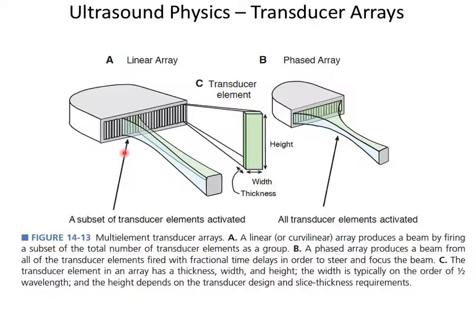So remember, the object that was in the echo tech's hand is called the transducer, and the business end of the transducer that's placed on the patient is here, that surface. It's laid down on the patient, and usually there's electronics coming out the back of this thing, which we will see. And here are the piezoelectric crystals themselves, cut to a certain size and geometry.